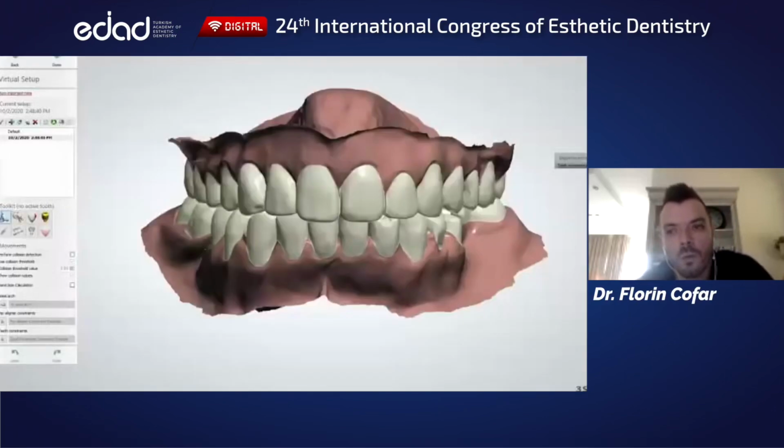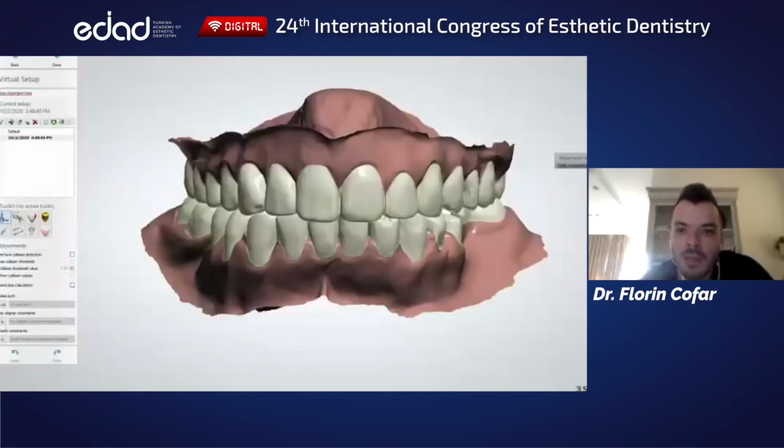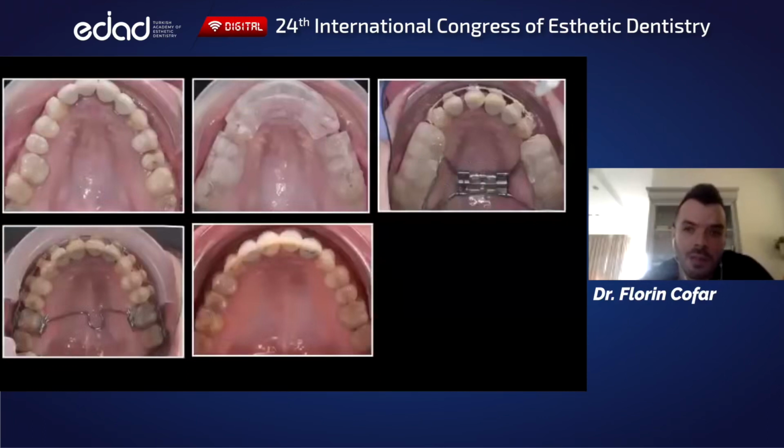So what we're doing then, once we've done that design with the patient, is it becomes one of the pillars of collaboration. I would just send this to the orthodontist. The orthodontist would turn it into a setup where you would plan everything accordingly. And then the approach through ortho is usually to always start with the TMJ and muscles, and here it is splint therapy to create that muscle passivity and to have a stable joint.